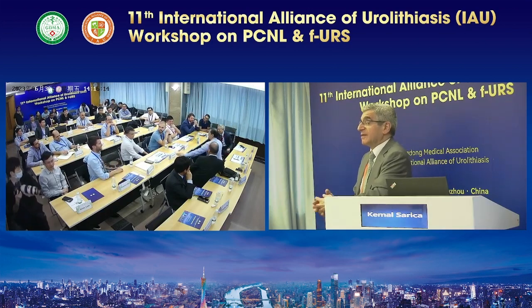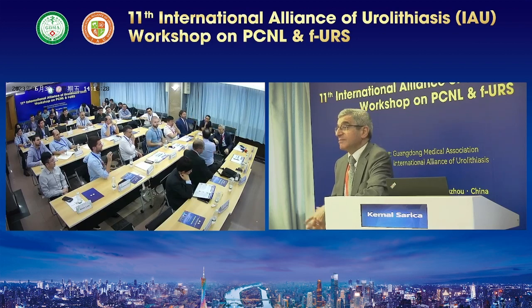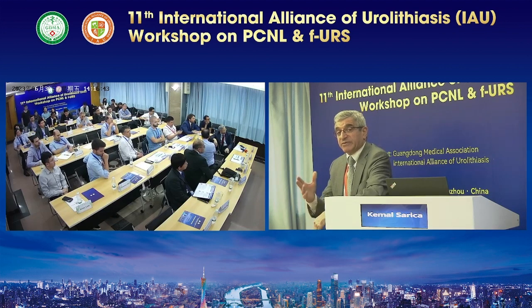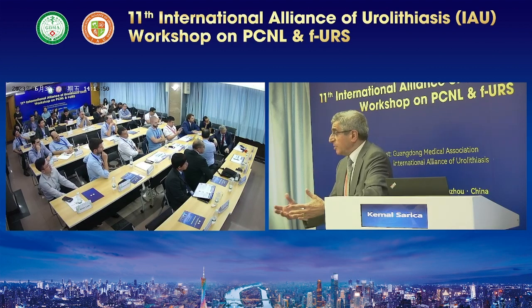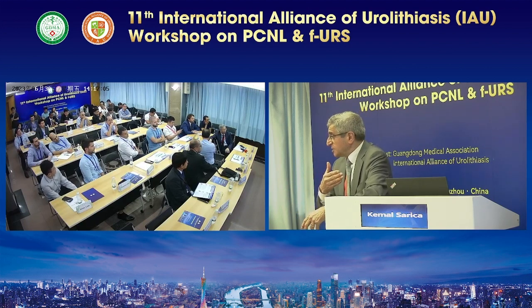Just a question to you, Professor. What do you think will be the most important innovation for these disposable scopes? The size or some additional devices like the pressure measurement or the vision? It has been discussed during this workshop already. Sizes are coming to the lower edge, and we now have 7.5 Fr. It was a breakthrough for tight ureters requiring no ureter accessories, and also in children. In addition, we discussed a pressure transducer on the tip of the digital single-use scope, which has shortly been introduced, I think.